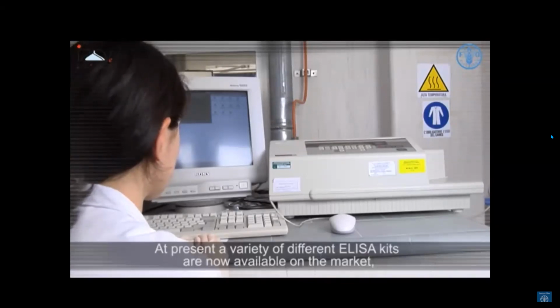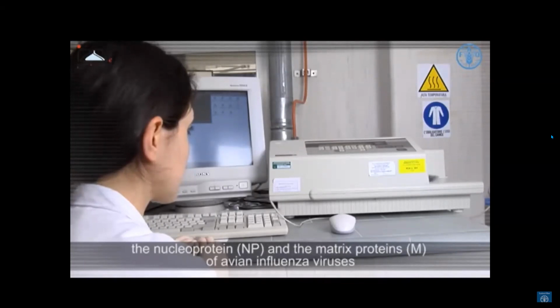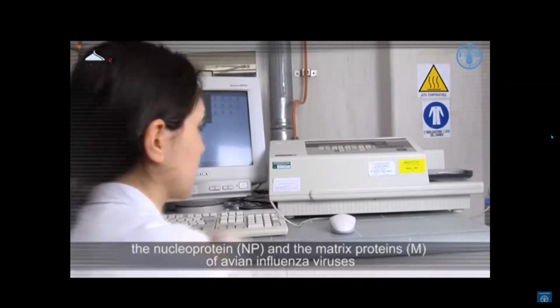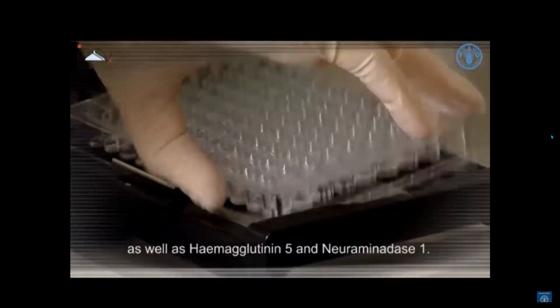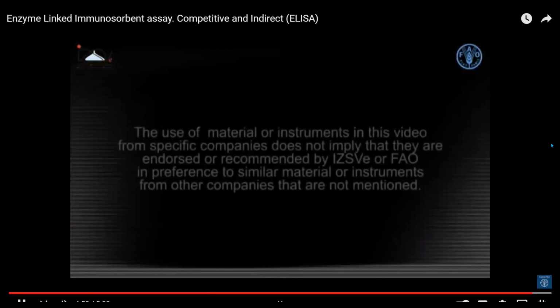At present, a variety of different ELISA kits are now available on the market, allowing for the detection of the presence of specific antibodies against the nucleoprotein, NP, and the matrix protein, M, of the avian influenza viruses, as well as hemagglutinin 5 and neuraminidase 1.